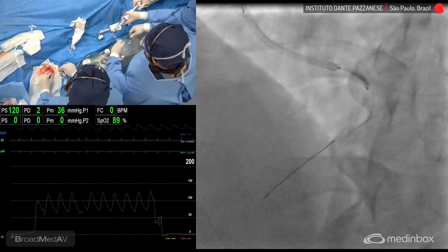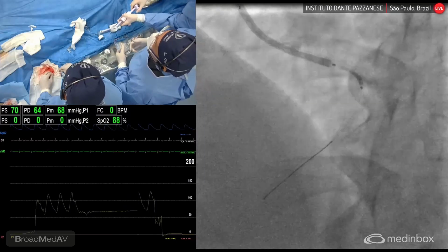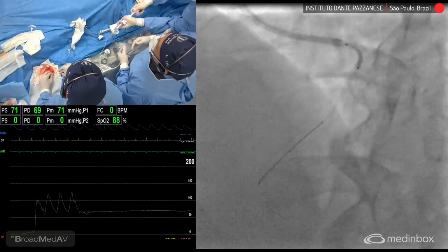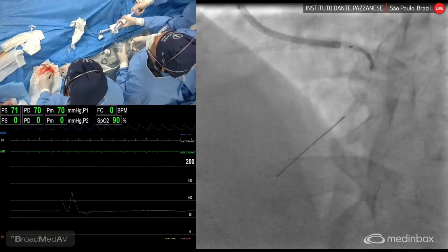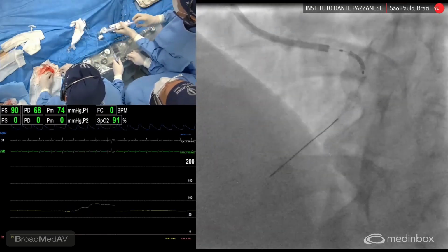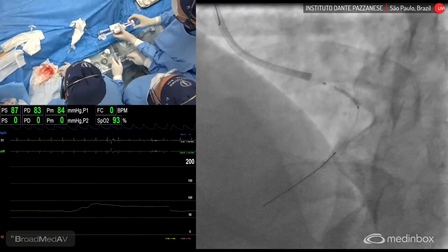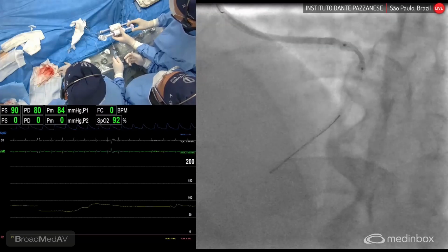Let's do some tests here, because you have to make sure that you are in the right place. Let's pull back a little bit. Okay, so avoid a big breath. Yeah, okay, perfect. So we got the position.